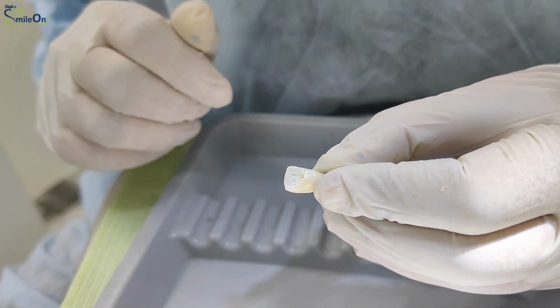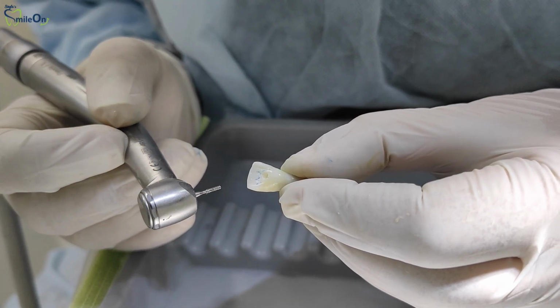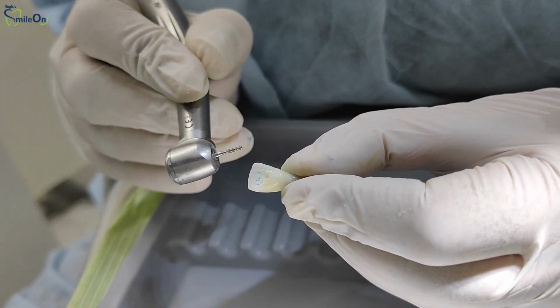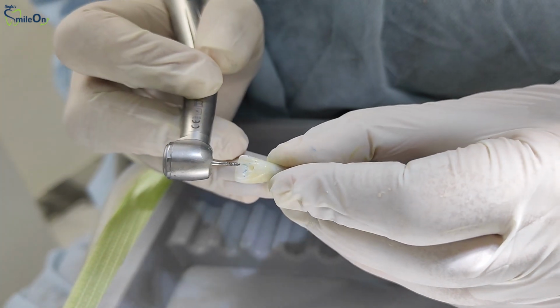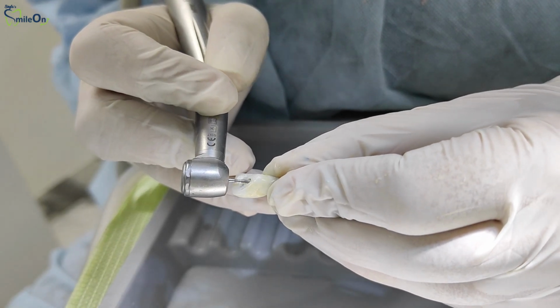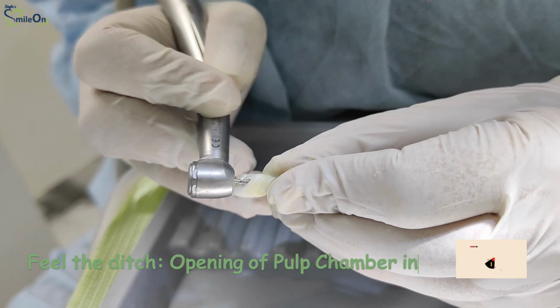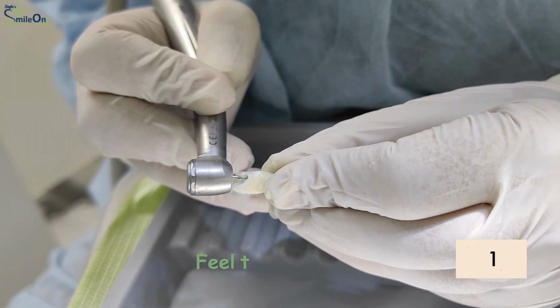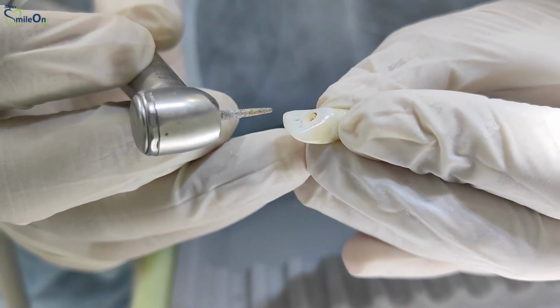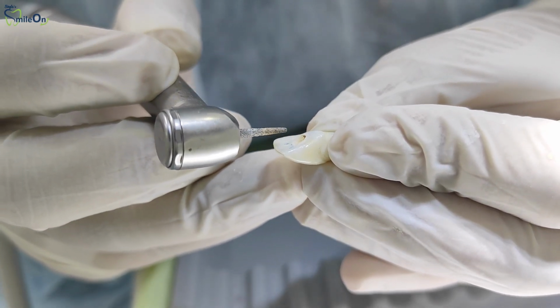Now we have to change our burr from the round burr to a straight burr. With the straight burr, the angulation which was initially perpendicular to the crown of the tooth, now we have to make it parallel to the crown. So we have to make it further deeper with the straight burr. Now I am extending this preparation to completely de-roof the pulp chamber.